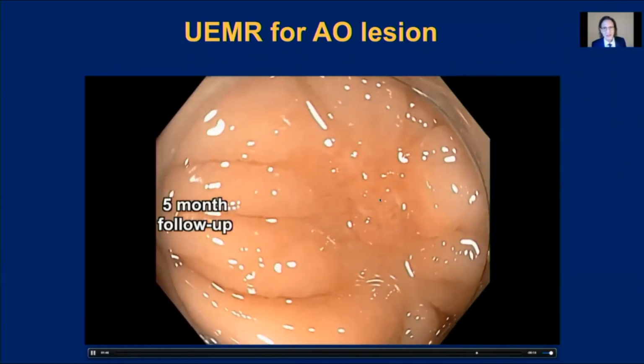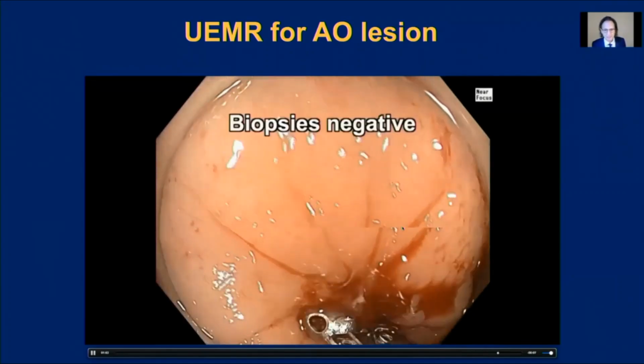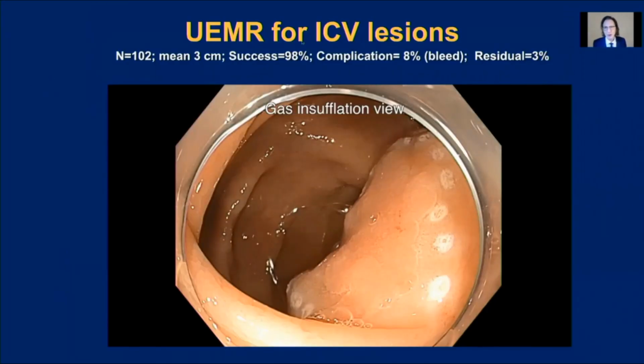So this is the appearance at 5 months, nicely scarred, and of course we biopsied this multiple times. So I reported on this experience removing AO lesions in 2015, and our complication rate was very low at 7%, only pain, but importantly, none of these patients developed appendicitis. And that is a concern when we use full thickness resection technique that is now being used using full thickness resection devices.